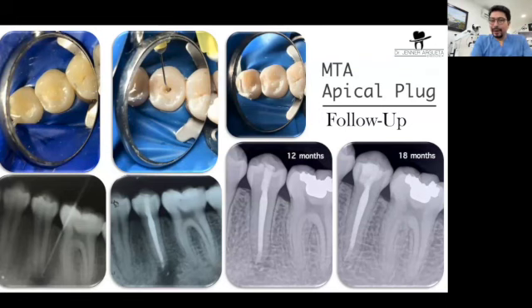But going back to the clinical results, this is a case managed by me. A long time ago, I would say I performed this treatment maybe 8 years ago. The pictures were taken with an iPhone. They were taken with a cell phone, and as you can see, the pictures are acceptable. You can also notice that by that time we weren't working with digital radiographs. We were still working with regular radiographs.